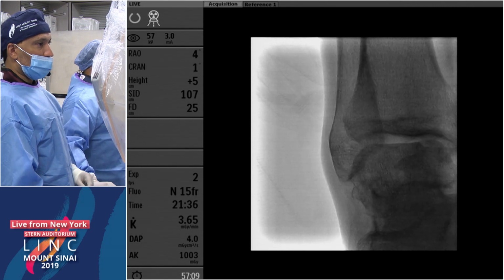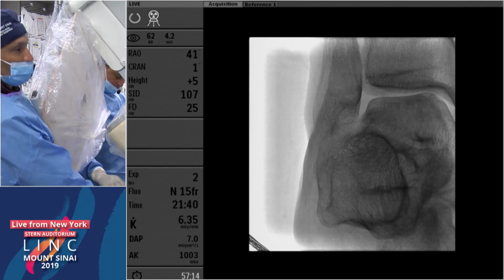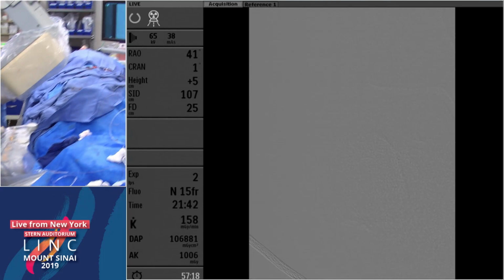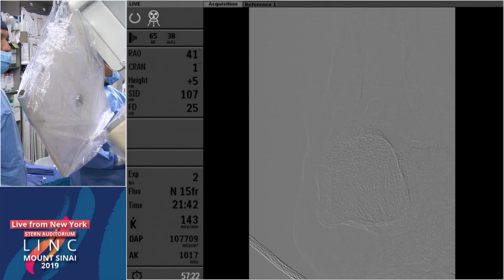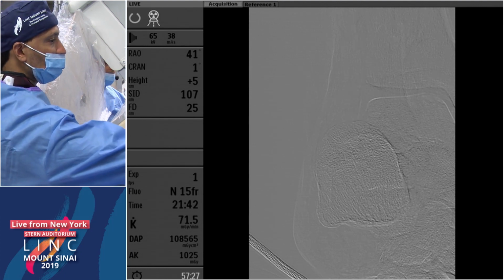and as a physician, I tell the fellows, it's not about avoiding complications. It's about when complications happen, what do you need to do, as you showed very beautifully in this case here. And you took us through the thought process. Why did you end up deciding to place a covered stent versus just treating it with balloon angioplasty?